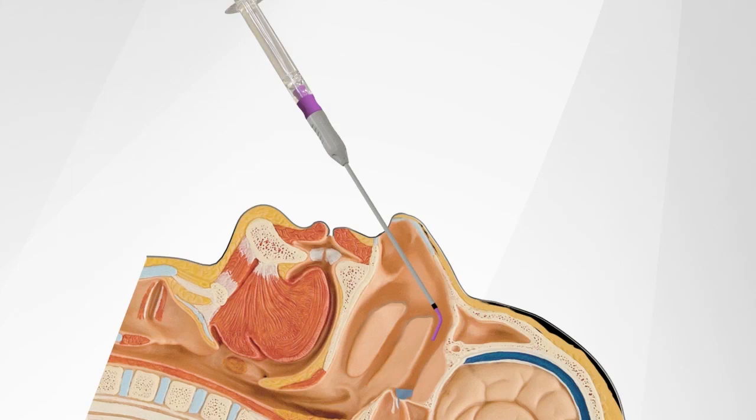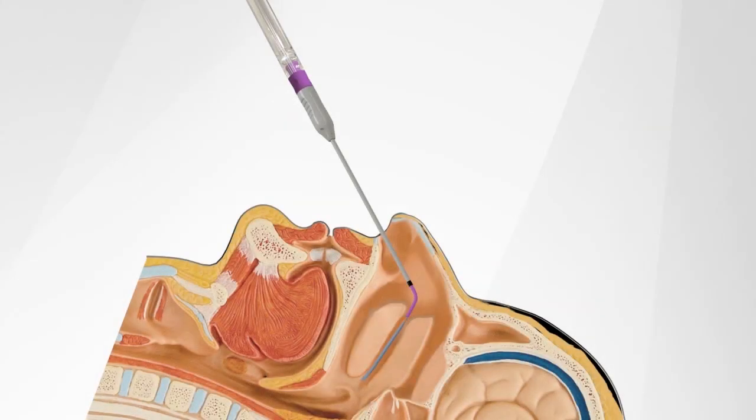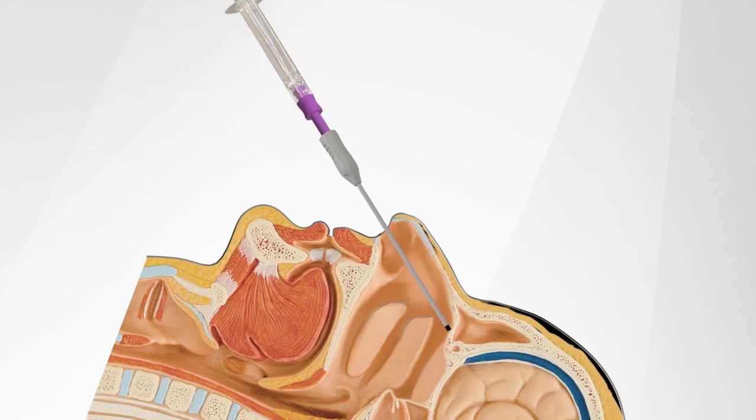If the patient feels a significant amount of lidocaine run down the throat, the catheter has likely been placed in front of or below the middle turbinate, which is too low. In this case, make sure the patient's head is tilted far enough back. Withdraw the inner catheter to straighten the device. Reposition the catheter to achieve a steeper incline relative to the bridge of the nose by lowering the hub and syringe closer to the patient's lips. Make contact with the nasal bone, withdraw 1 centimeter, deploy inner catheter, and repeat injection of 1 cc of 2% lidocaine.